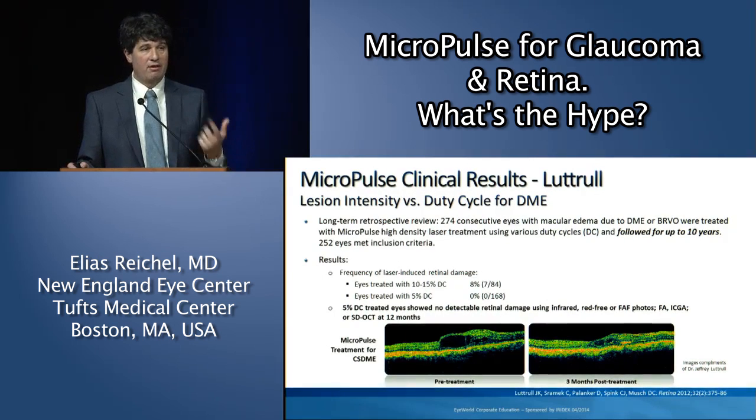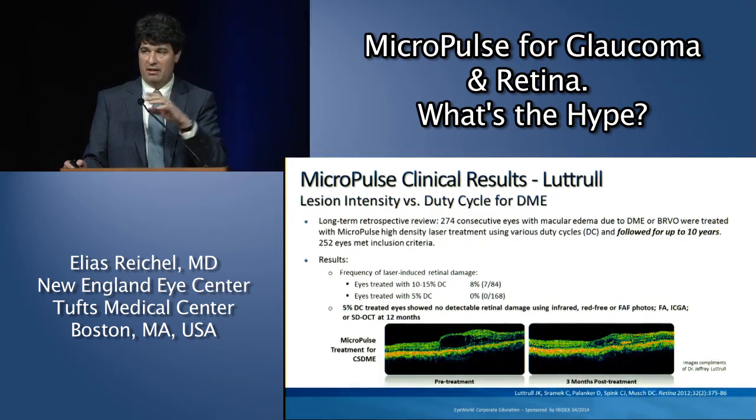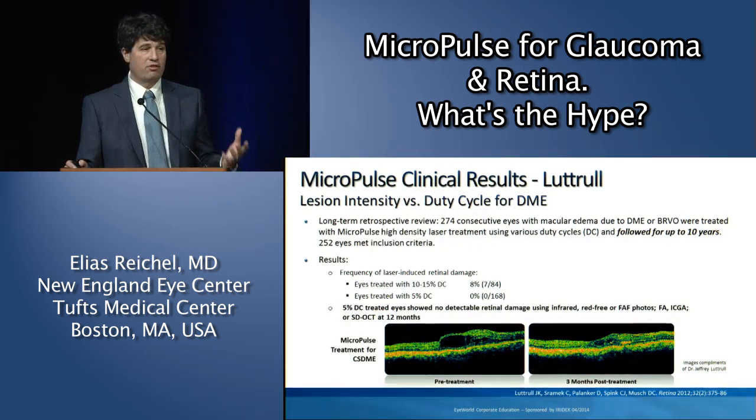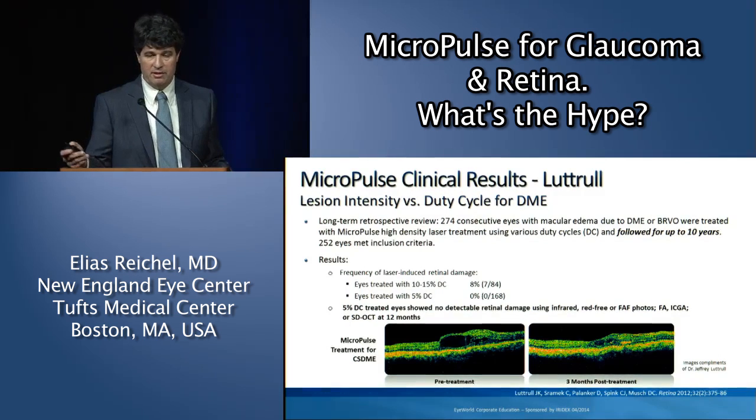But if you go to a higher duty cycle, you may have laser-induced retinal damage. And if you go to a 10 or 15% duty cycle, you're seeing about 1 out of 10 patients developing some kind of retinal damage. So it's important to remember 5% duty cycle. And this is long-term follow-up. These patients were followed for up to 10 years.